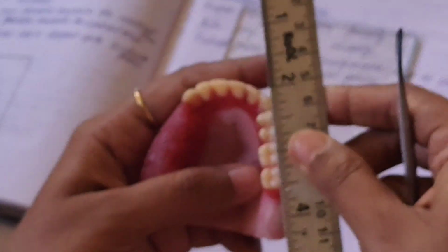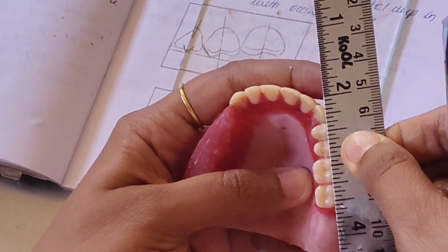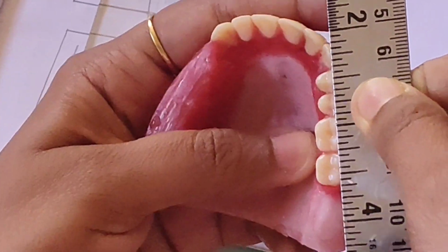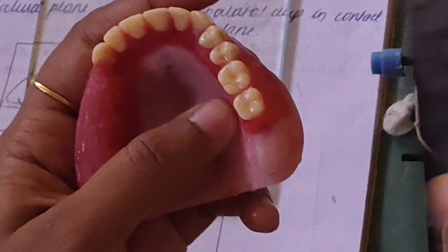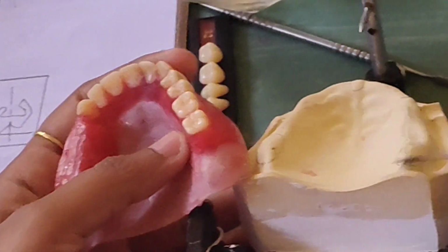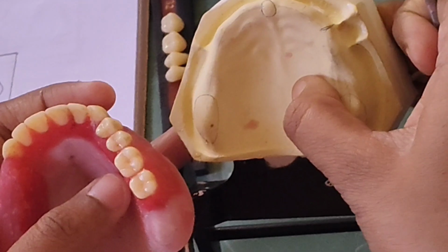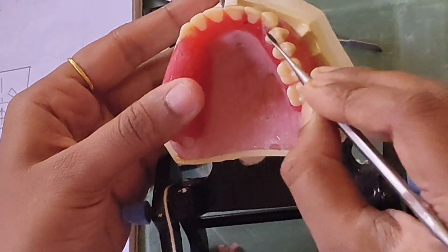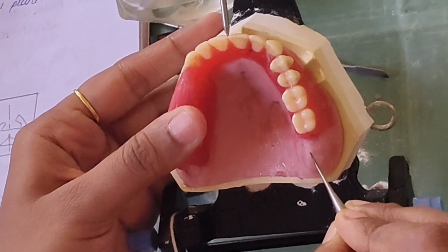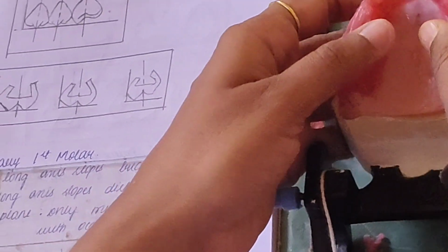Then when we are arranging, we have to make this in one line. From here, automatically it will come over the ridge. If it comes over the ridge, then only it is proper. It should not go buccally or palatally. If we pass this line over here, it is coming over the ridge. This we have to see.